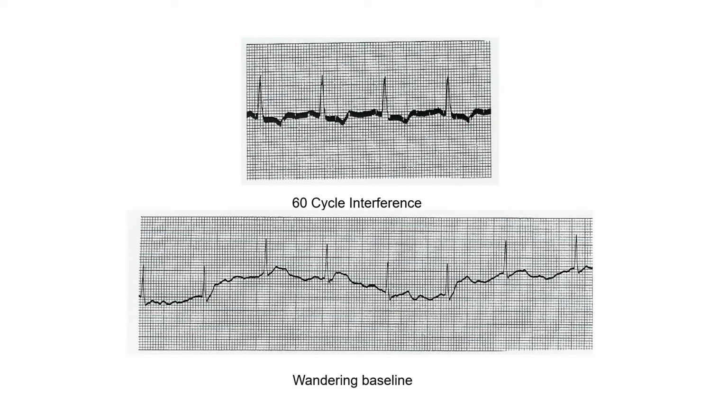The top one you probably won't see too often, but what causes it is a leakage of current. It can result from multiple pieces of equipment in use or from improperly grounded equipment, exposed wires or loose connections. And what it'll pick up is this weird baseline. So what you need to do is disconnect any equipment not in continuous use and begin to unplug other equipment until the cause is identified or it removes that staticky look. Just don't unplug the vent.